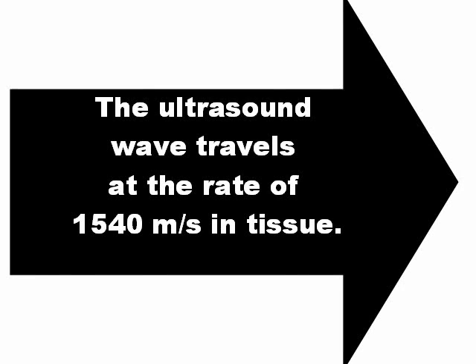Another assumption is that ultrasound always travels in medium or soft tissue at 1540 meters per second. This is not always true.